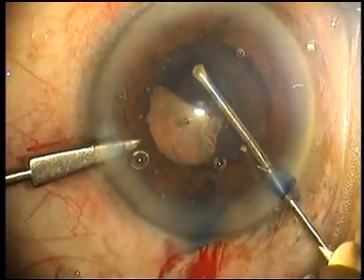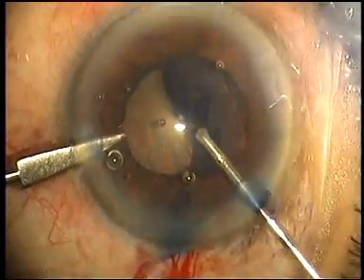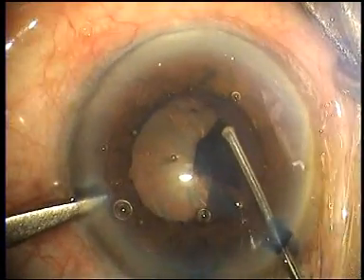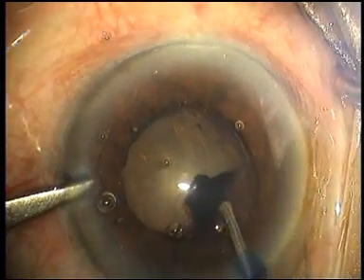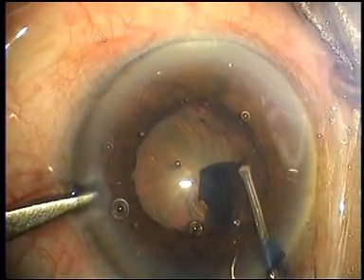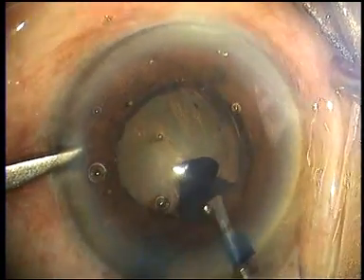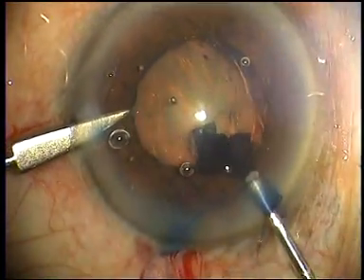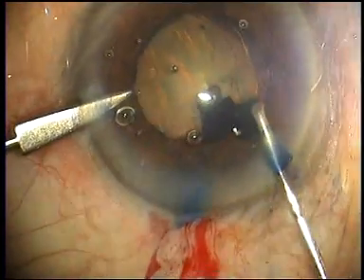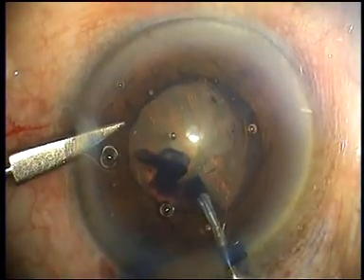These cases tend to have fragile anterior capsules which will also tend to wander into the periphery into the zonular area, creating the risk of zonular dehiscence and the possibility of untoward incidents during surgery.